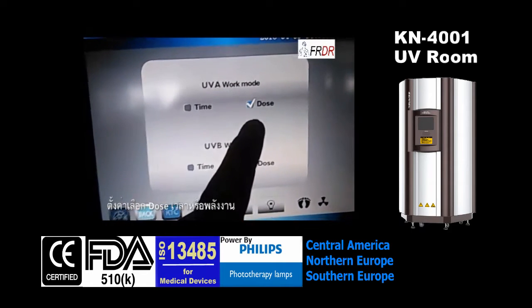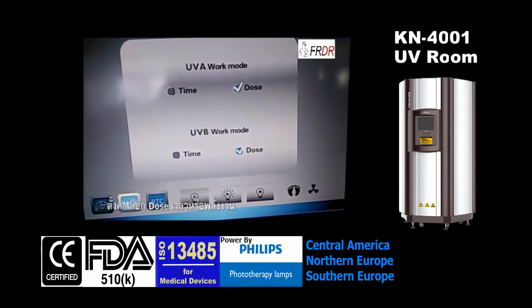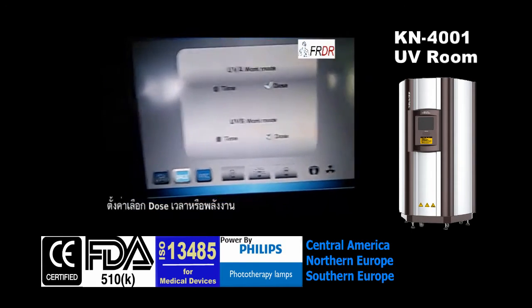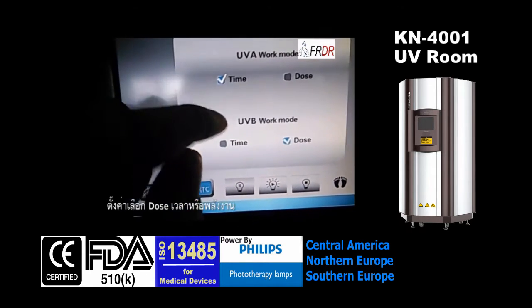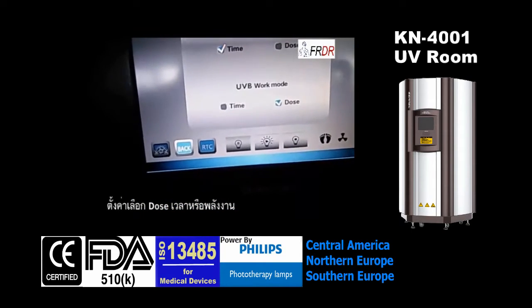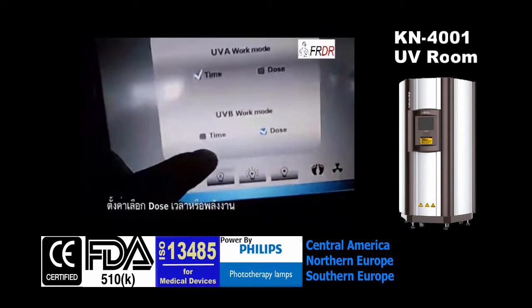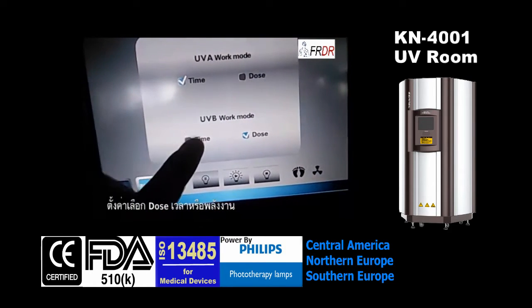By pressing here we can choose UVA or UVB. This machine can run in dose mode or time mode. If we choose dose mode, when we start the treatment we can input a nominated dose for this machine. When we choose time mode, we can just input a time, maybe 40 or 45 seconds, for a single treatment. Since this machine only has UVB lamps, we choose time mode.